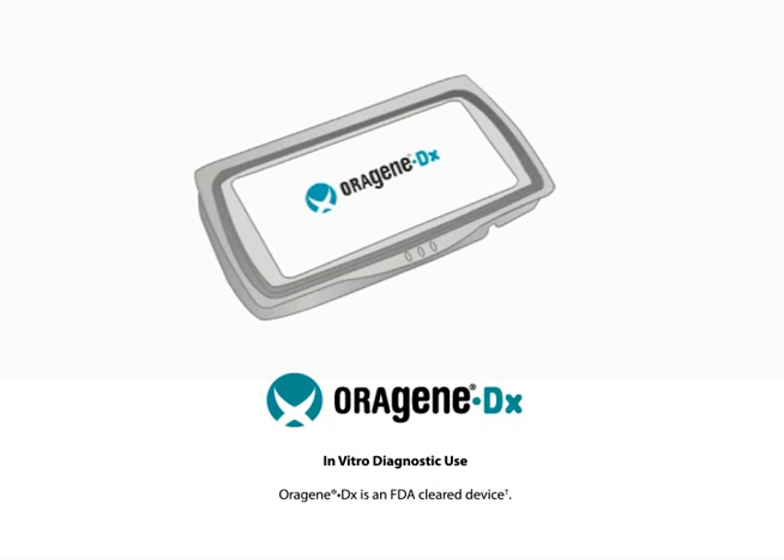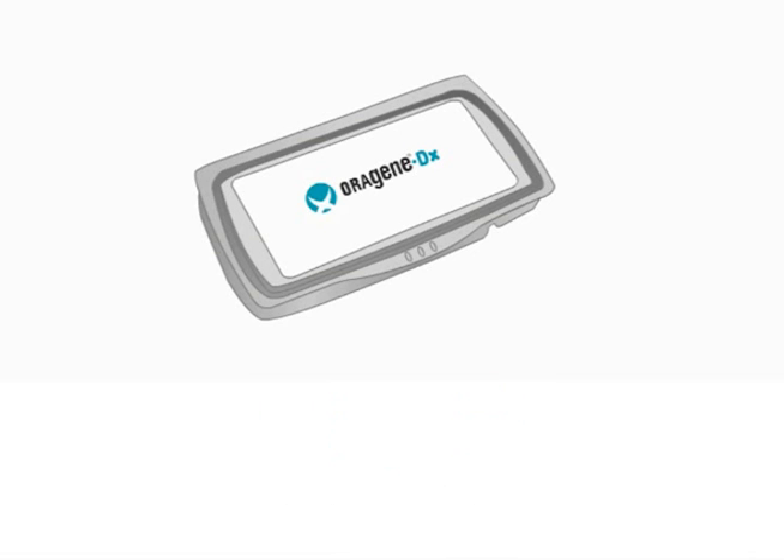The Orygene DX self-collection kit is proven for the collection, stabilization, and transportation of DNA samples from saliva. Orygene DX is an FDA-cleared device for in vitro diagnostic use in the United States.